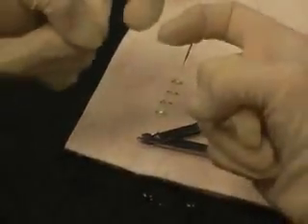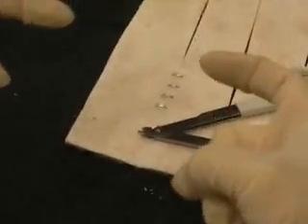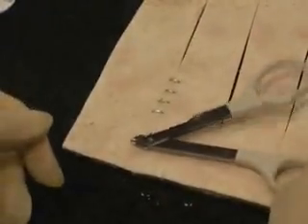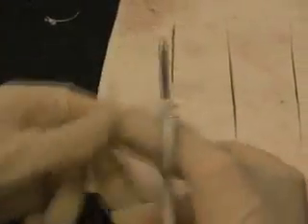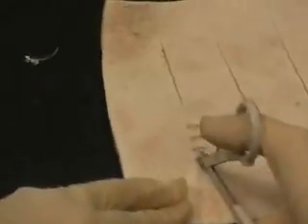Whereas if you do that step simultaneously, where you're straightening and pulling out at the same time, you're going to tend to pinch and hurt the patient. They're going to jump a little bit. So it's a two-step procedure. You put the instrument underneath, squeeze, then pull up. Squeeze, pull up. Not at the same time. So for instance, you don't want to go like that. You can actually even hear that hurt a little bit. So it's a squeeze, then pull up.